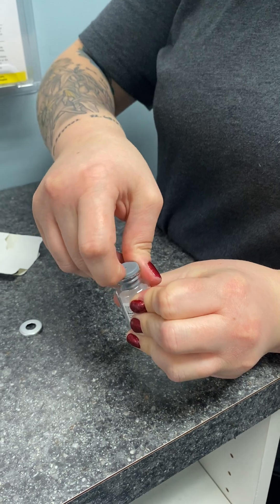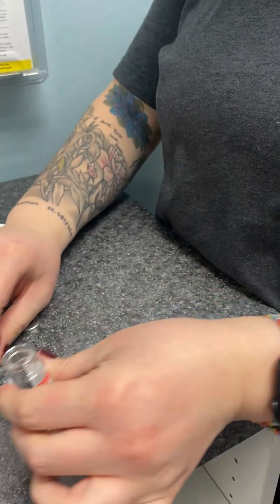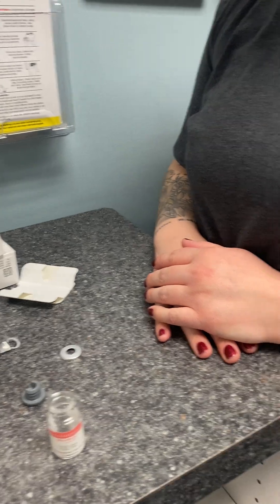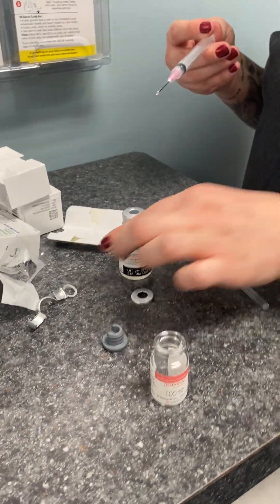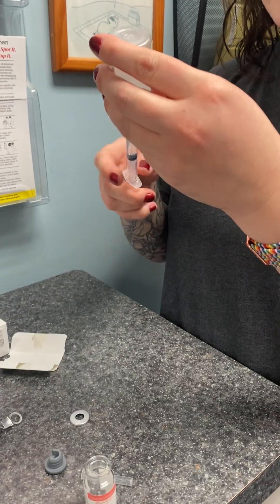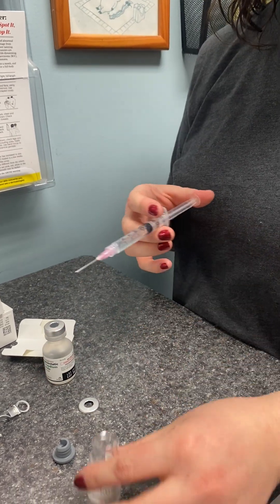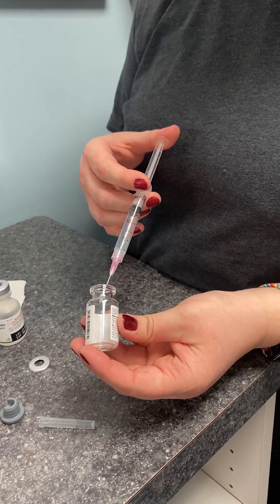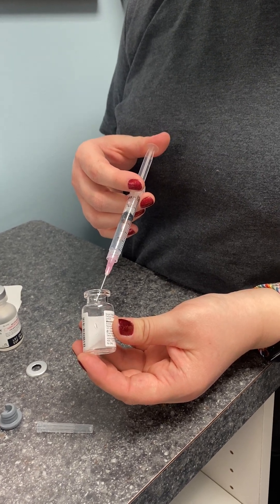With all of these, the concept is the same — you've got this protein in there in powder form and you want to be really delicate with it so you don't denature it. Juveau is a little different because we mix it with 2.5cc of bacteriostatic saline. Derica draws that up and slowly injects it down the side of the bottle, just dripping it in so that you don't denature the protein.